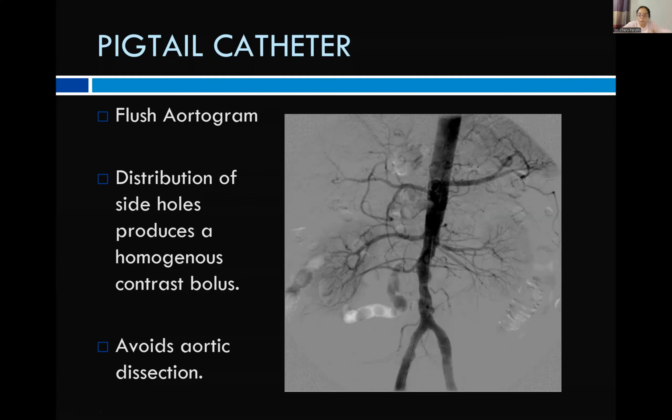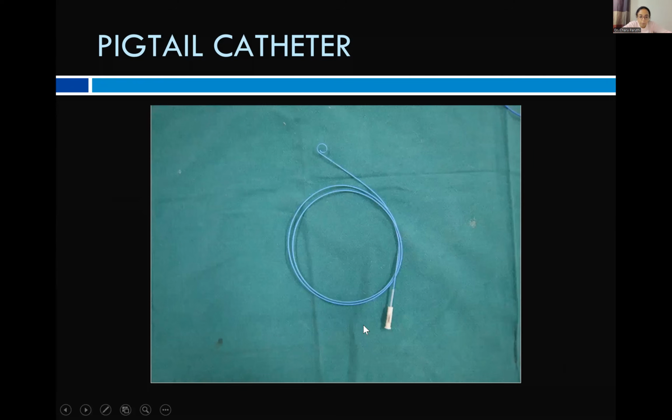So all the catheters at their hub, this is the hub of the catheter, have the French and the inch written. So French is the outer diameter, inch is the inner diameter. So 6 French catheter has a 6 French outer diameter. And if it says 038, 038 is the inch, which is the inner diameter, which means that a 038 inch guide wire can go inside this catheter, 038 or smaller. And 6 French means that a 6 French catheter is going to go inside a 6 French sheath. So for sheath, it's the inner diameter in French. For catheter, it's the outer diameter in French and inner diameter in inches.